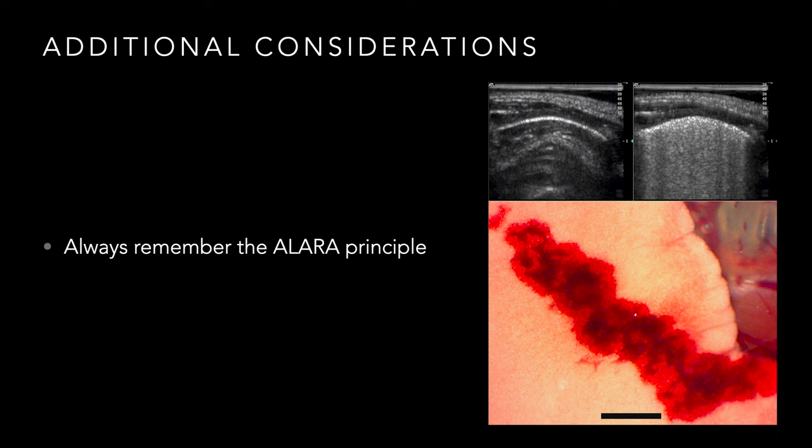And they've looked at what are the things in ultrasound that will increase the risk of pulmonary capillary hemorrhage? You know, just ventilating the rat's lung, or just positive pressure, or like, I guess one of the studies was adding PEEP. Does that do it? Do certain sedative agents do it? Do certain machine settings do it? And they were kind of teasing out what causes increased risk and decreased risk.